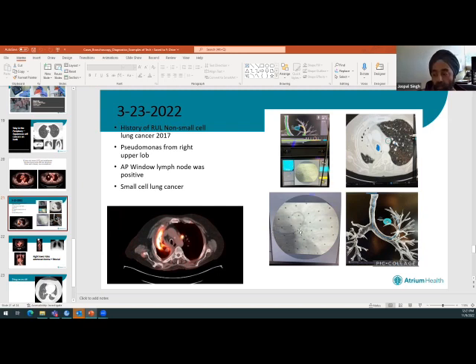And you see my catheter makes a little bit of a U-turn there, a little J curve there. I actually biopsied this and showed that it was a different type of cancer called small cell lung cancer. So we are getting to newer parts of the lung now with much more precision. And this patient had an answer, and it changed his treatment completely from what we were thinking he had. So we're getting better at it.